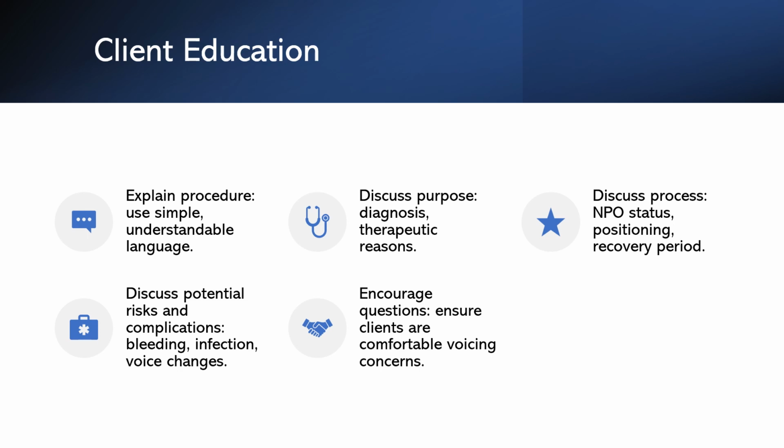Let them know about being NPO for a few hours before the procedure, the positioning during the procedure, and the recovery period. It's also important to discuss potential risks and complications such as bleeding, infection, or changes in voice. Remember, informed clients are empowered clients. Lastly, encourage questions. This isn't a monologue, it's a conversation.